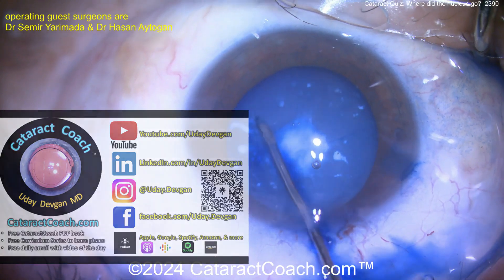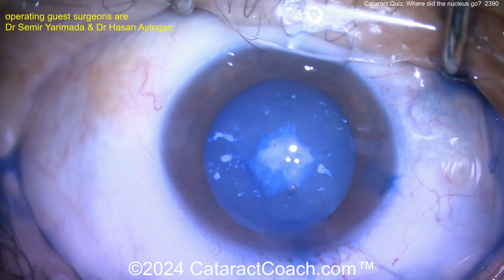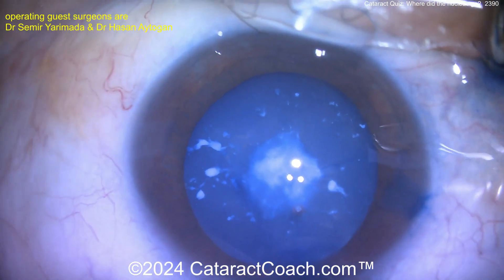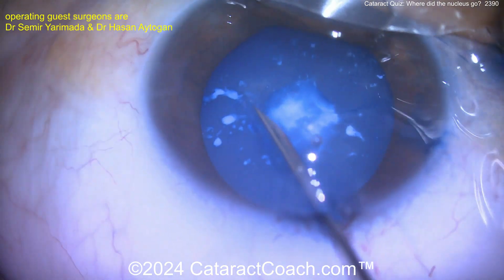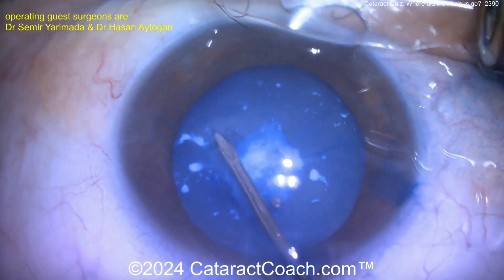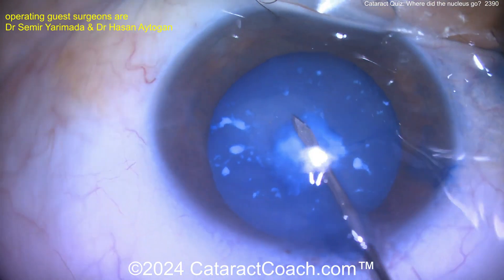Going in again with the needle — look how difficult it is to even pierce that lens capsule. Trying to get in there — what do you think is going on here?